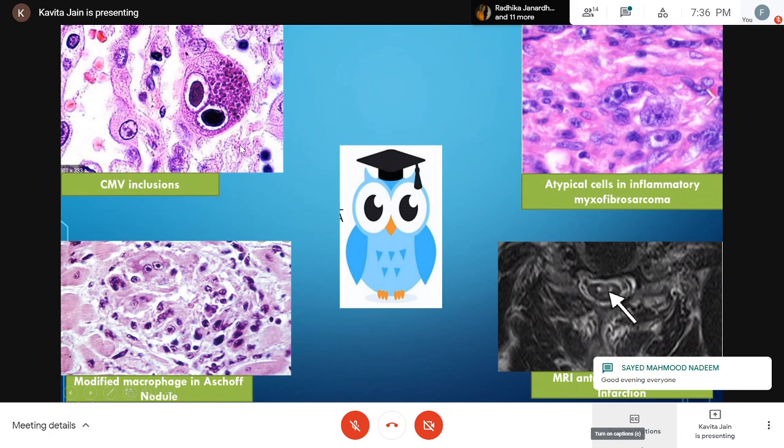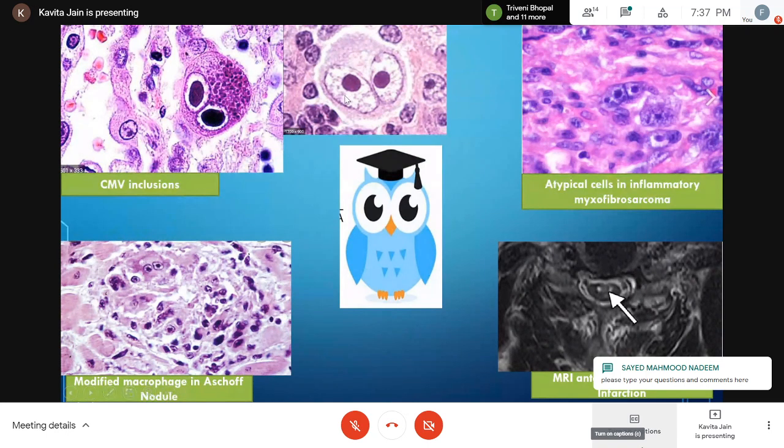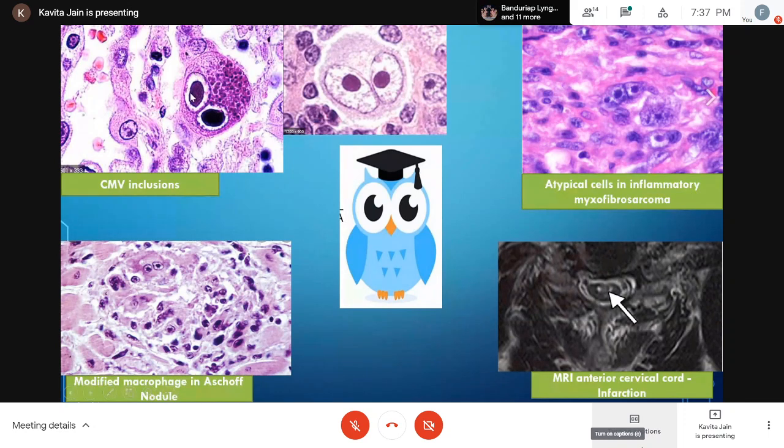Now coming on to the CMV. It is a commonly asked question, how do we differentiate between the intranuclear inclusions of cytomegalovirus and RS cells? If we move from inside out, first of all, these are not nucleoli, they are inclusions, and these are nucleoli. In a CMV inclusion, we see that these inclusions are basophilic, they are at least half the diameter of the nucleus, and they have a very good, clear-cut perinuclear clearing, peri-inclusion clearing, the nuclear clearing.